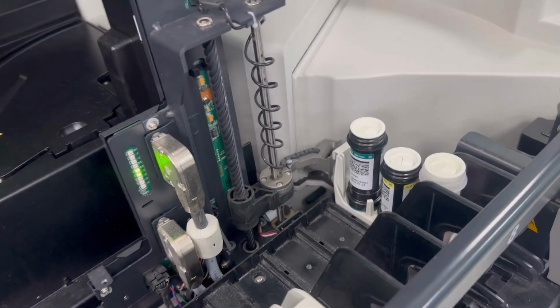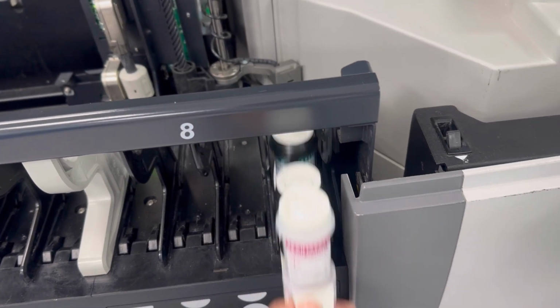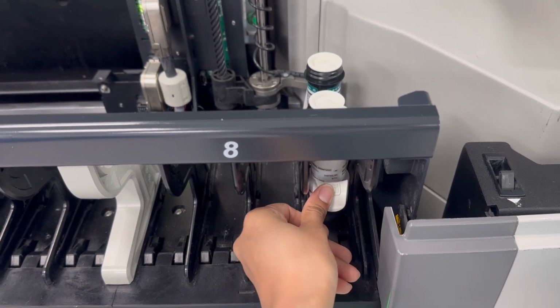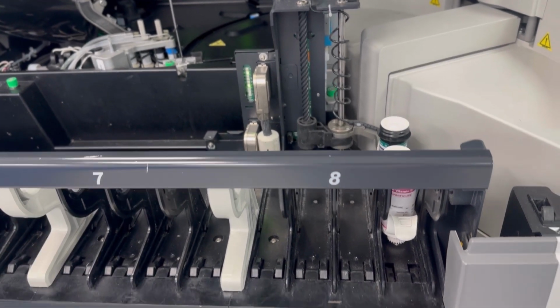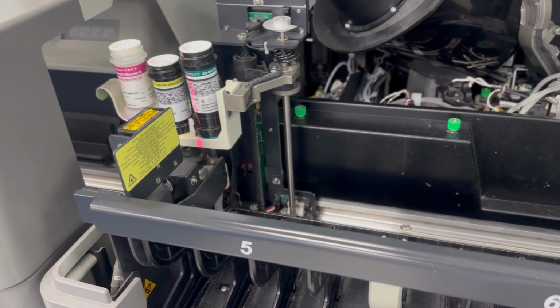Now going to the hormone part. This is the hormone part. The reagents are different from biochemistry to hormones. The hormone reagents are in this form, and this is how we put them. We are loading the reagent for hormones like this, and for hormones we don't need to switch off the machine, whereas for chemistry we need to switch off the machine to change the reagent.